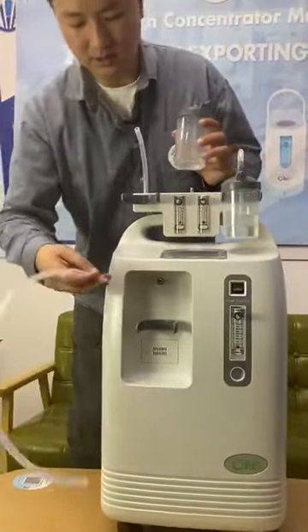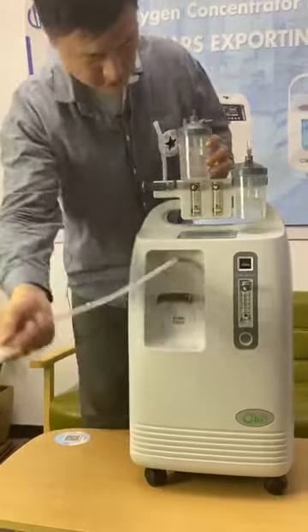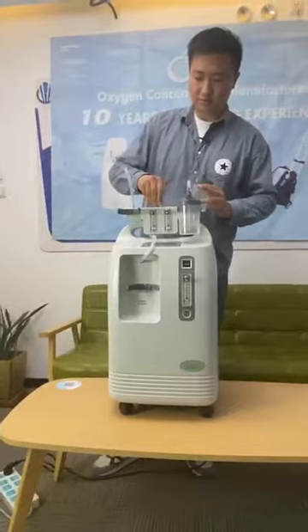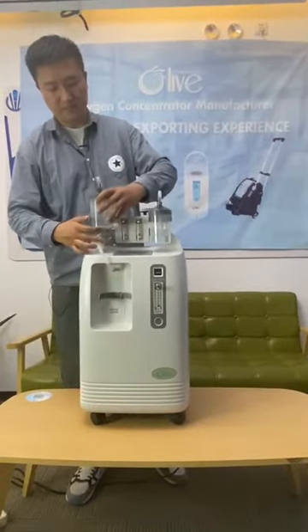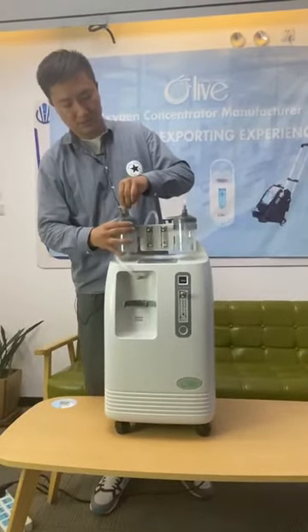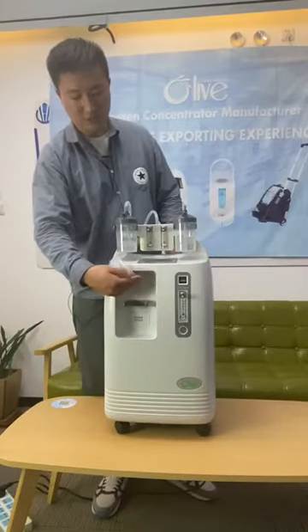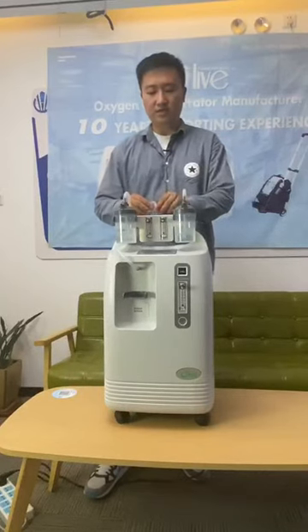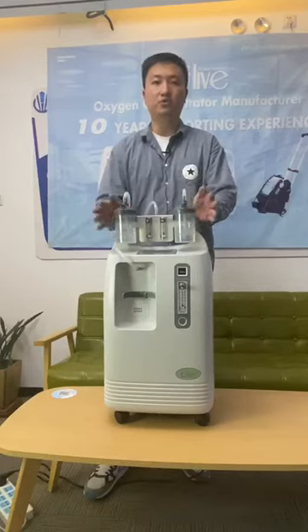Start connecting from the outlet all the way to the device on top. Then place the humidifier bottle on top and connect it to the device. From the output of the OLV-10S oxygen concentrator, it comes to the device and is separated into two outputs.